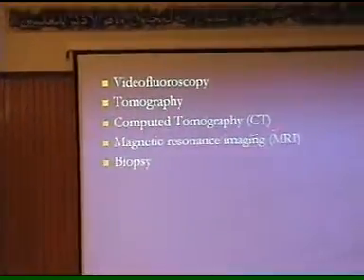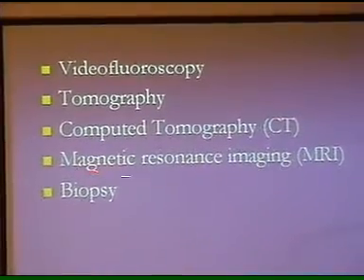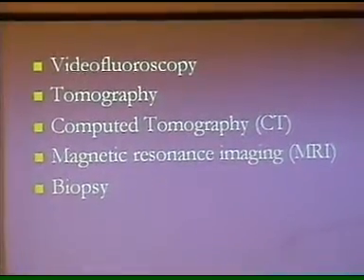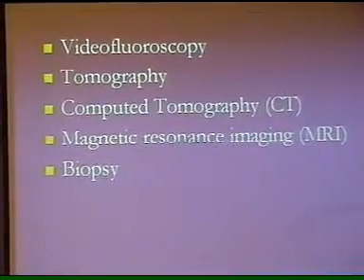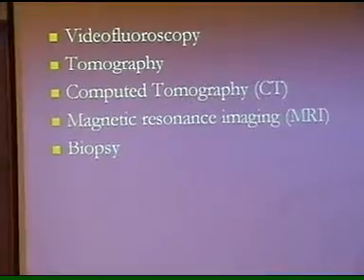Similarly, tomography is these days replaced by CT, which is 10 times more helpful than the X-ray. And still better, let me tell you, for any musculoskeletal pathology, MRI is very helpful. But if you compare ultrasound and MRI, number one, ultrasound is very much operator dependent. If I don't know it, I'm totally making blunders, but if I know it, then I can do the job.